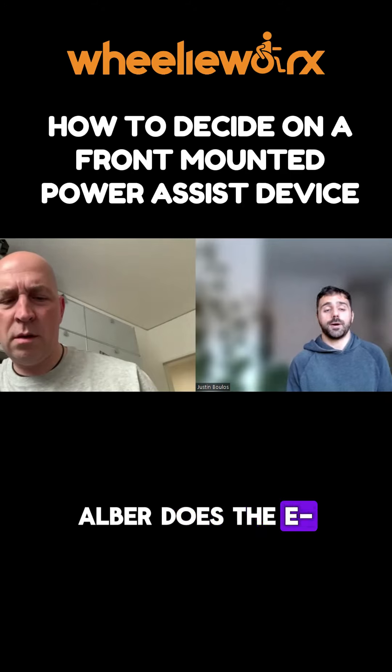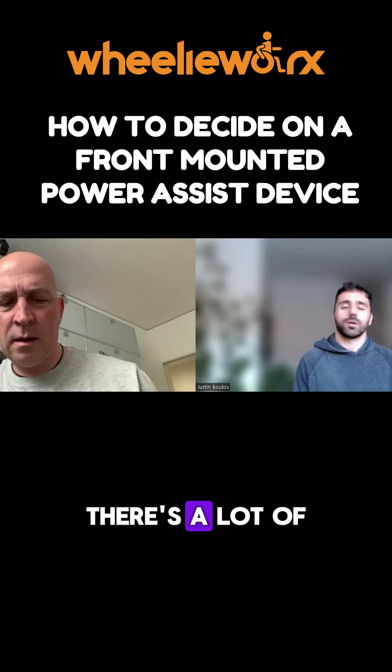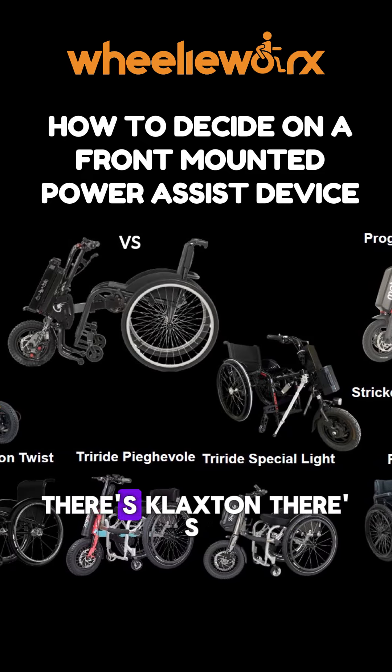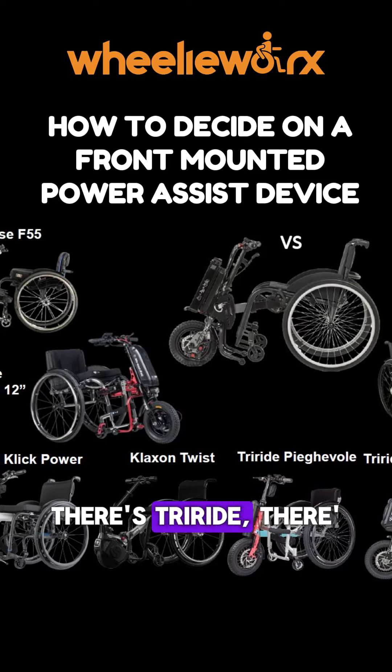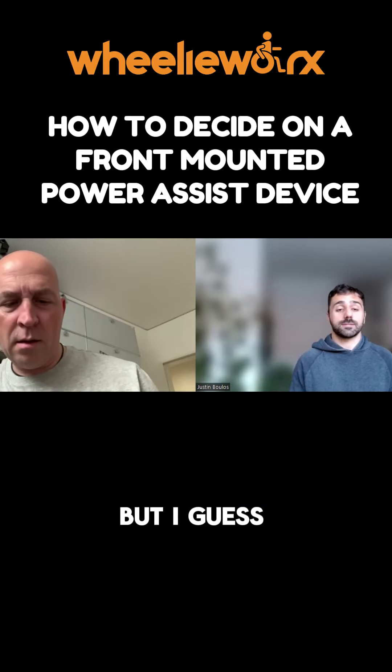Alber does the E-Pilot, which is a similar product, but there are a lot of brands. Especially in the past year I've seen more and more — there's Klaxon, there's Triride, there's Uniwheel, and plenty of other products that are out there.